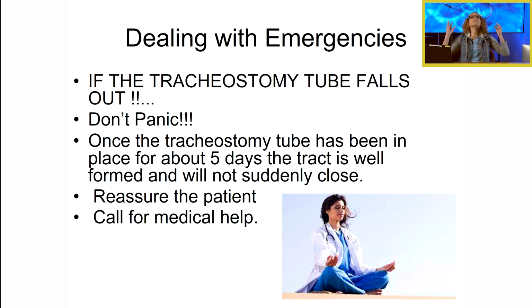So let's talk about dealing with emergencies, right? If the tracheostomy tube comes out, don't panic. The patient is watching you. The patient is looking to you to be confident, to be calm, and to be able to solve the problem, all right?